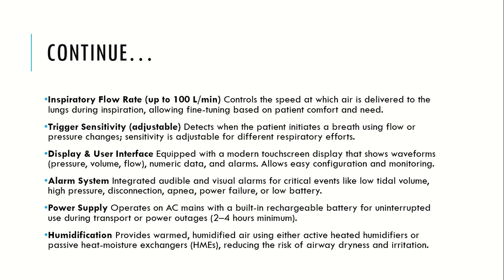The display and user interface is equipped with a modern touchscreen display that shows waveforms, pressure, volume and flow, and numeric data, and allows configuration and monitoring. Alarm systems have integrated audible and visual alarms for critical events like low tidal volumes, high pressure, disconnection, apnea, power failure or low battery.